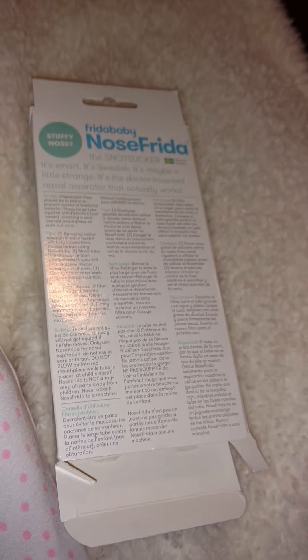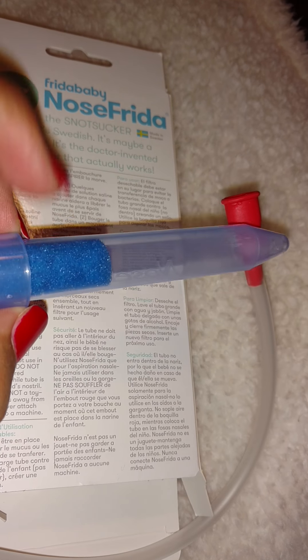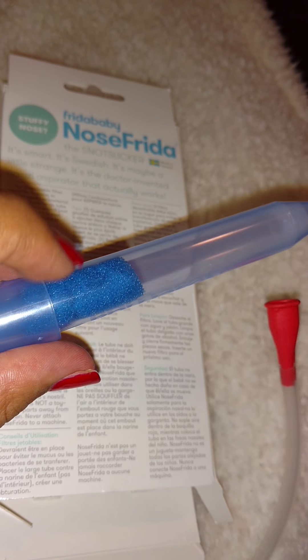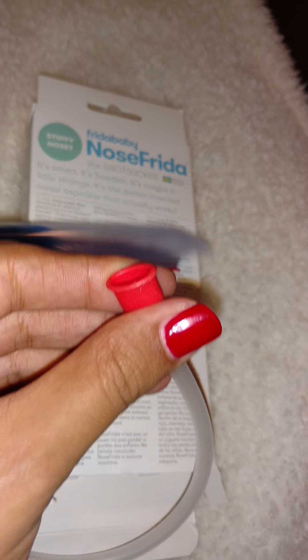It also says you can spray saline. Anyways, I put this little thing inside of here because it just snaps on and off like that. It says to replace the filter after each use, which it doesn't come with any other filters. This is the red tube, so I'm going to put that part in my mouth.